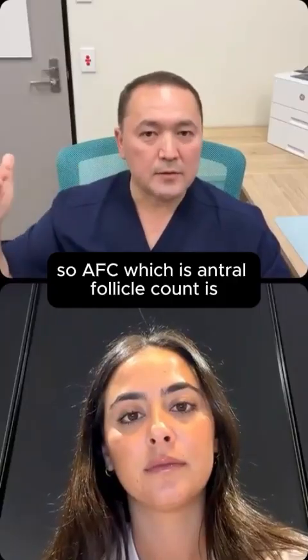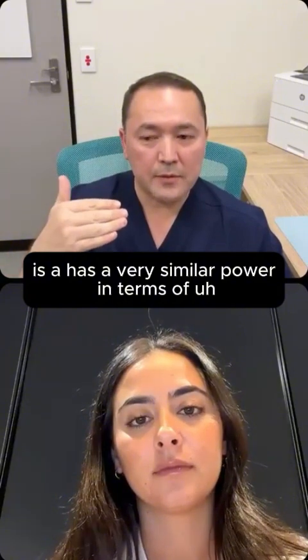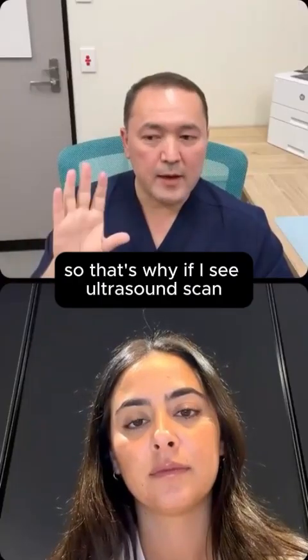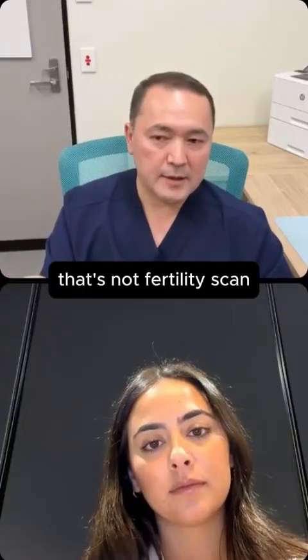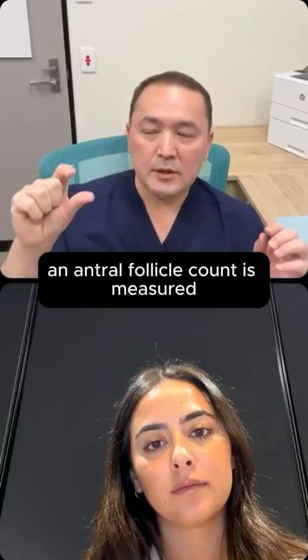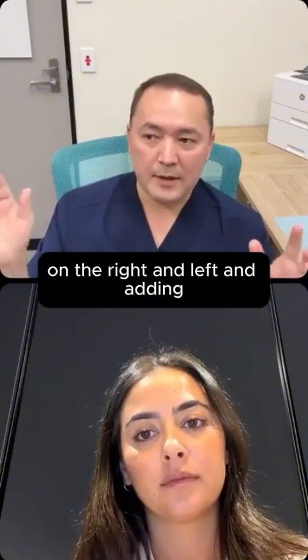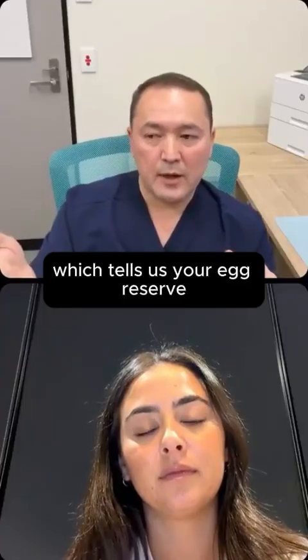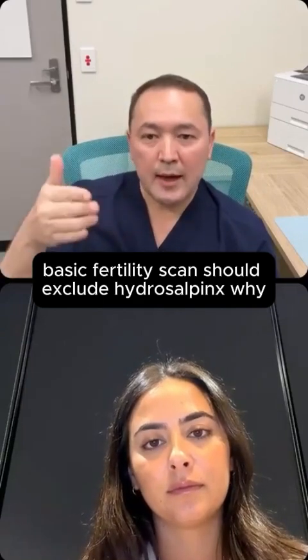So AFC, which is antral follicle count, has a very similar power in diagnosing your ovarian reserve as AMH. That's why if I see an ultrasound scan which doesn't tell me the antral follicle count, that's not a fertility scan, that's just a gynecological scan. The antral follicle count is measured by measuring each and every single follicle on your ovaries, right and left, and adding the right and left counts together, which tells us your egg reserve. Also, a basic fertility scan should exclude hydrosalpinx.